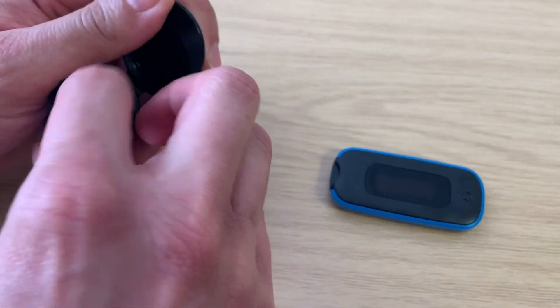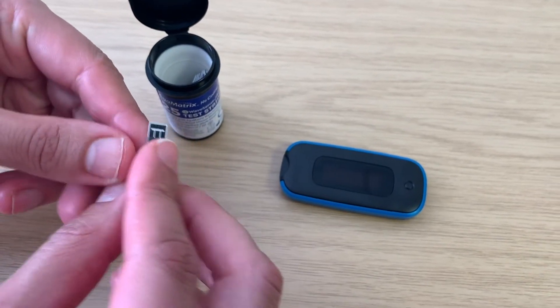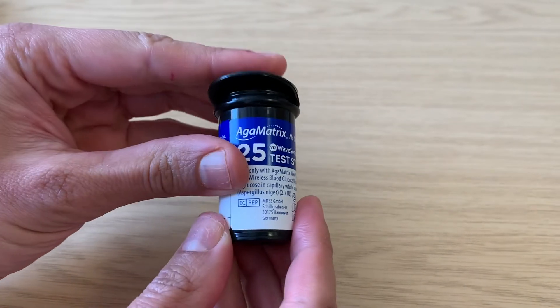To take a measurement, place a glucose strip into your meter. Ensure the end of the strip with the two lines goes into the meter and the meter turns on. Make sure you close the pot after each use.